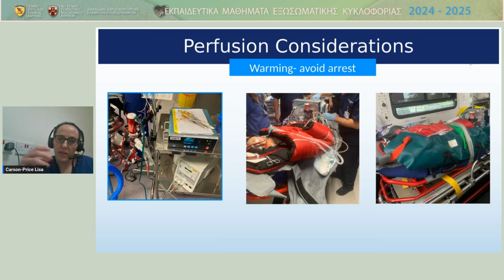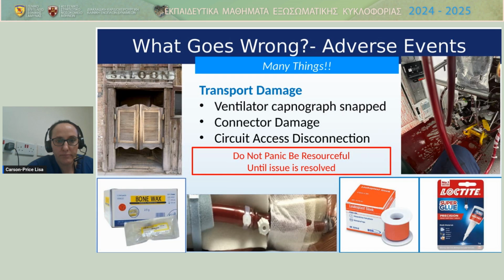So the final point, this is not in what's classed as a major adverse event, but I think it's really important, is warming or temperature control of the patient. With adults, it's not so much a problem, but with our pediatric patients, it's very important. They cool down very quickly and as a result can arrest. So by not switching on the heater cooler, or particularly when you've transported a patient somewhere, it can have seriously detrimental effects to our ECMOing.